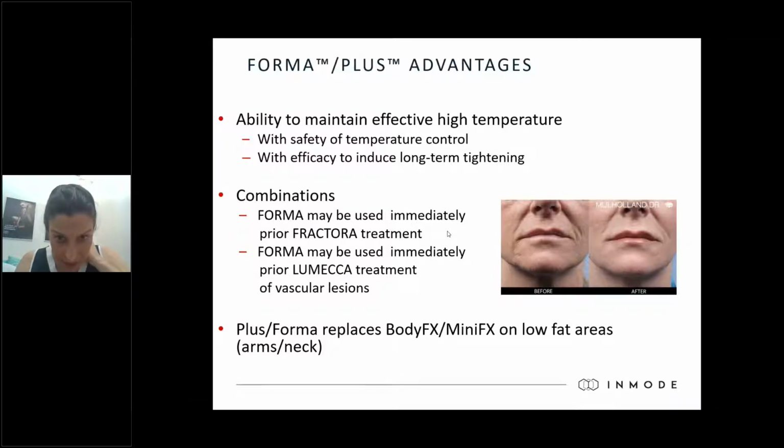Damages silicone implants, like breast implants. We're not treating, okay, this is a good question that has to be covered thoroughly. As I said earlier, any silicone implants, injections, whenever silicone is involved, we're not treating. We don't want any possibility of causing leakage of silicone into the body. It is super risky. There are many generations of silicone implants and injections, and these patients, these areas are banned. So no treating over silicone.